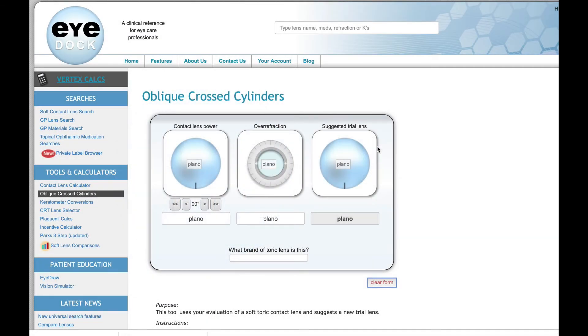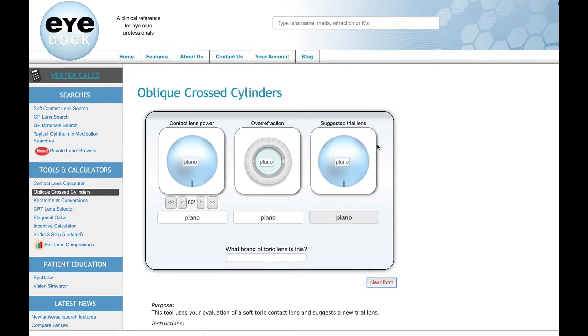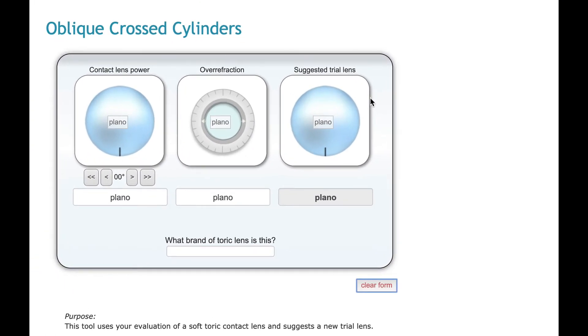Hi, everybody. This is Todd Zarwell, and I wanted to show you EyeDock's Oblique Cross Cylinders Calculator, which is something that I know I personally don't use on a daily basis, but I find very useful in certain situations. When you're logged into EyeDock, you can go to the Oblique Cross Cylinders page, and you'll see a form like this.